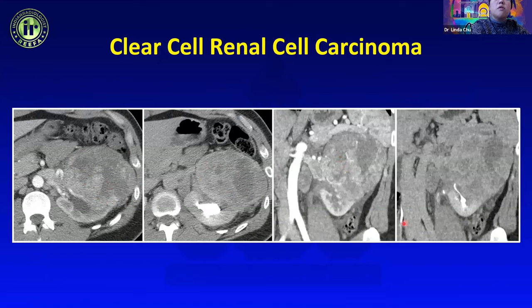Chromophobe RCC is the third most common type of renal cell carcinoma. These tend to enhance more slowly and more homogeneously. This earlier example shows a homogeneous, hypo-enhancing mass — very typical for chromophobe — with low-level hypo-enhancement, more homogeneous than what you would expect for clear cell.